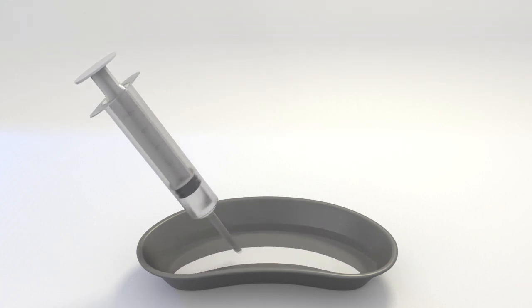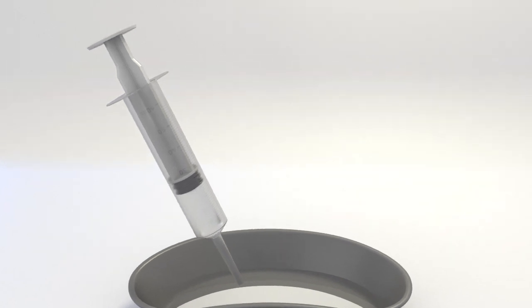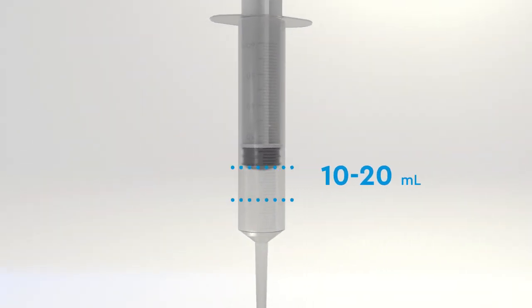Pour the warm saline into a small basin, then draw up 10 to 20 milliliters using your catheter tip syringe.